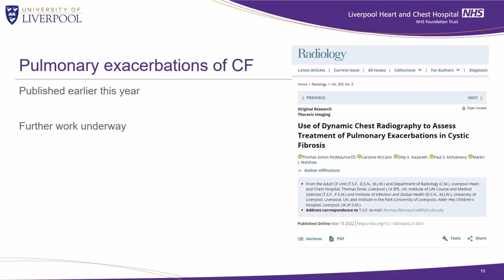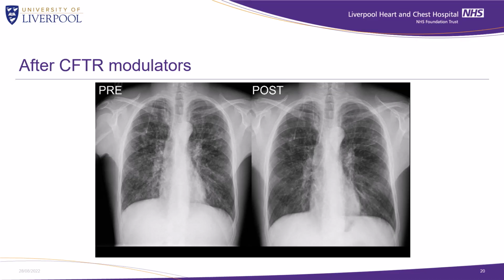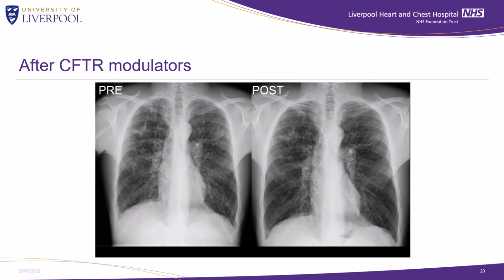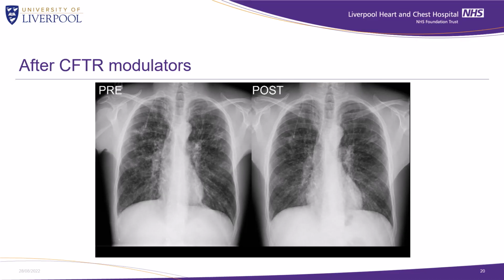We're now looking at further cases for calculation of lung volume subdivisions using the 2D projected lung areas calculated automatically from DDR images. On a similar note, here are some images from an individual after combination CFTR modulator therapy. You can see the range of chest wall area change and resting expiratory diaphragm position have both improved following initiation of triple combination CFTR modulators.